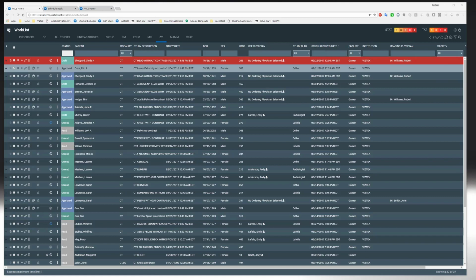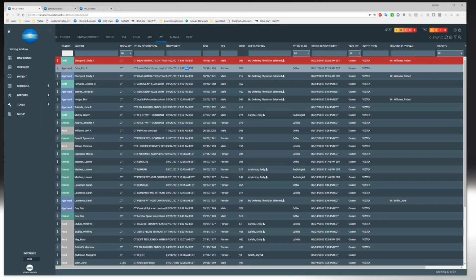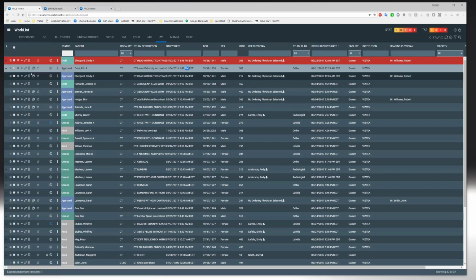But larger hospitals are typically going to have all of the suite of needs, including things like scheduling and so on. At least the data hooks, whether it's by HL7 messaging or directly through our interface, we need to collect a lot of data and make it available to a lot of people.